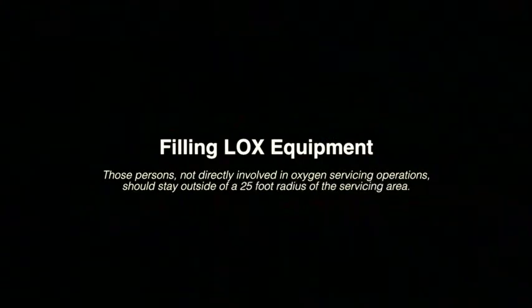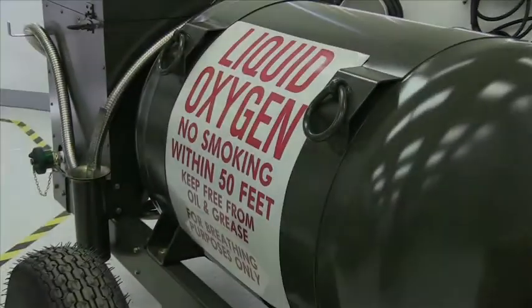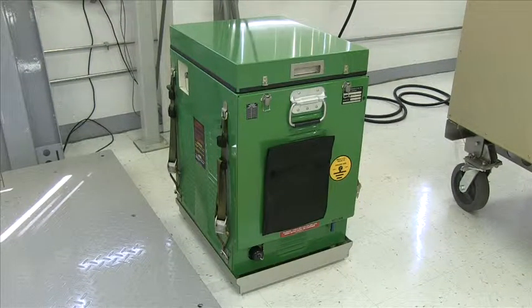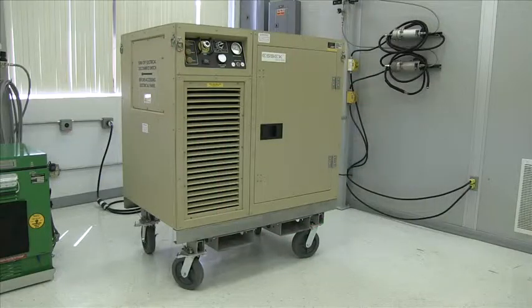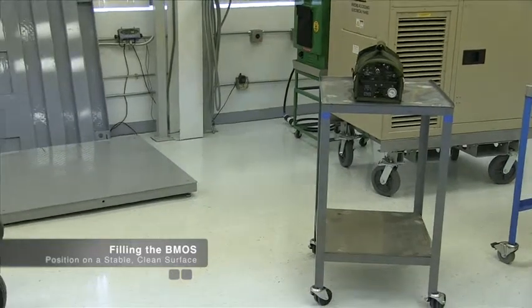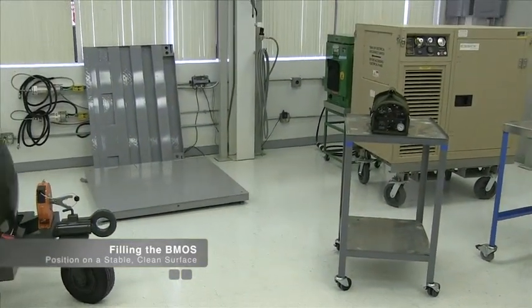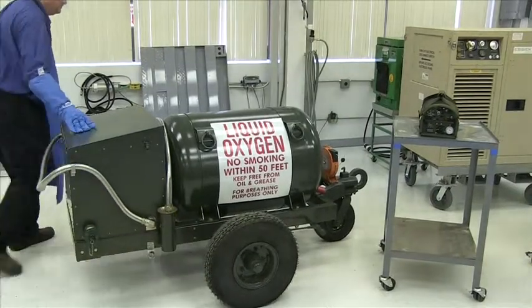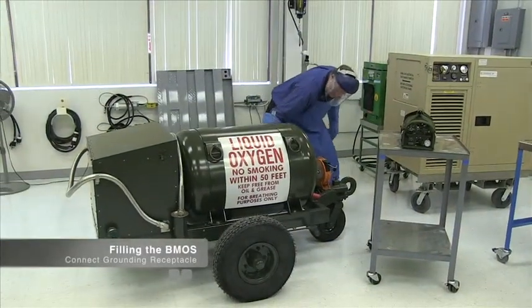Before beginning the filling procedure, please note that persons not directly involved in oxygen servicing operations should stay outside of a 25-foot radius of the servicing area. For demonstration purposes, a 50-gallon LOX cart, backpack medical oxygen system filling station, also referred to as the BMOS filling station, and an oxygen generator or liquefier, also known as an OGL, will be used for the following procedures. We begin the filling procedure with the BMOS, demonstrated here with a 50-gallon LOX cart. First, position the BMOS on a stable clean surface with the servicing fill valve downwind such that the liquid oxygen exiting from the vent port will not come in contact with any personnel or any hazardous materials. If required, connect the unit's grounding receptacle to an approved earth ground connector.